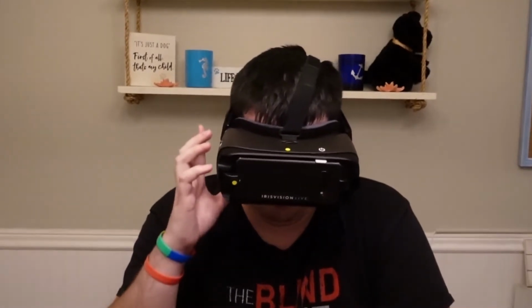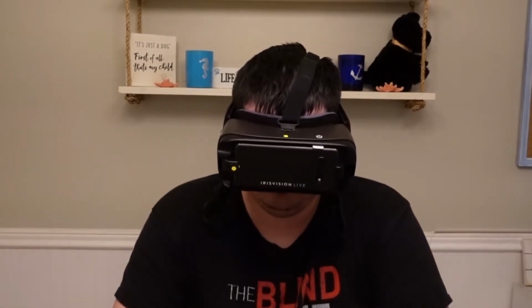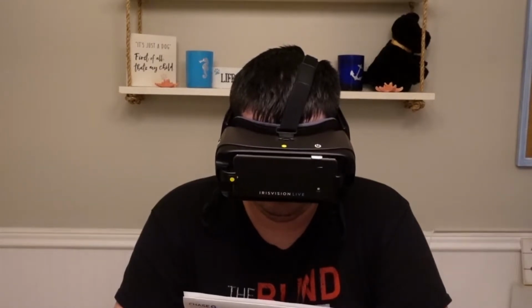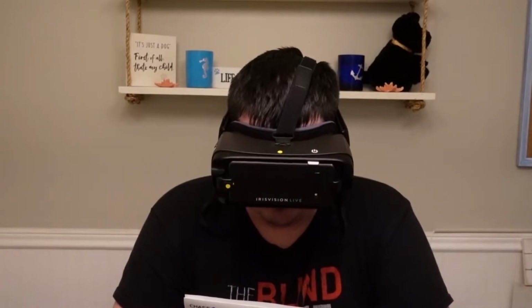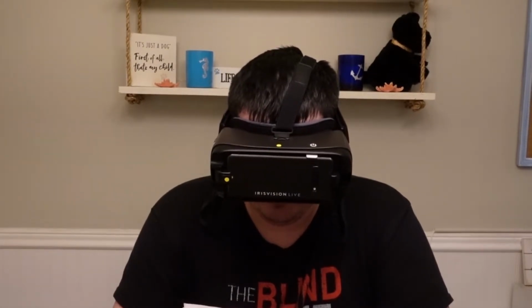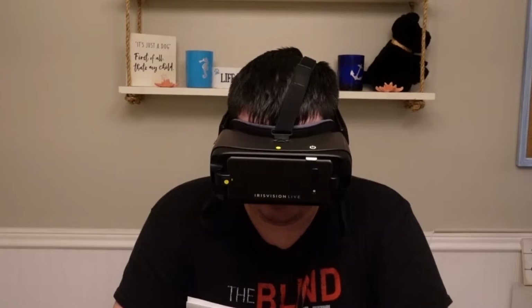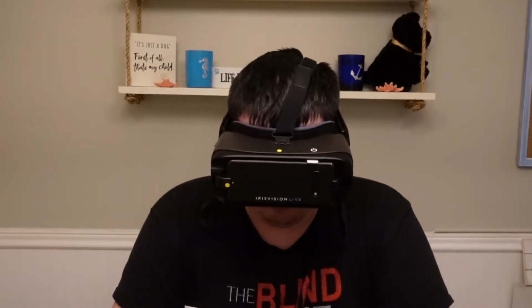All right. Let's go ahead and go to reading yellow. Reading yellow. Same as the last one, except black text on yellow background. I like this one too, honestly. I think it's not bright in terms of the white. So I think having a different hue, it's a little bit dark, but it's not distracting. I think it can work.